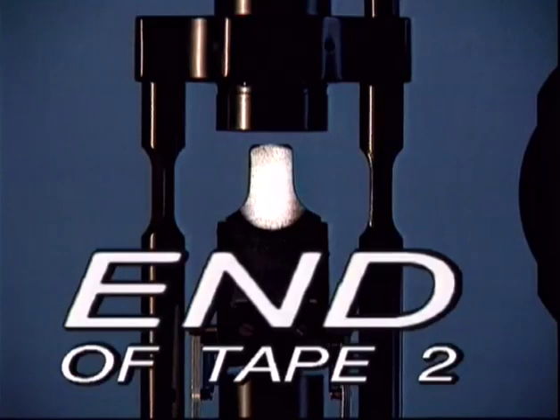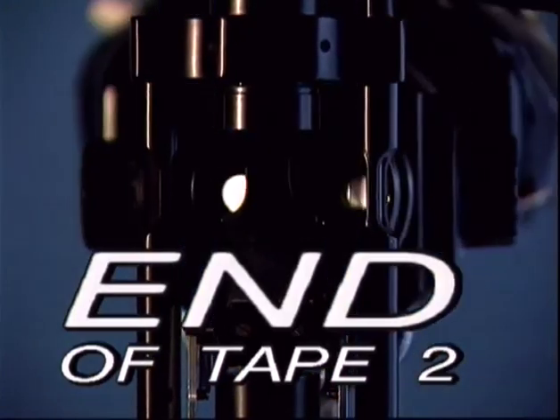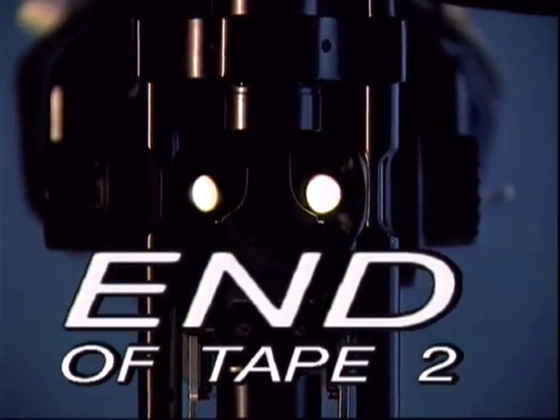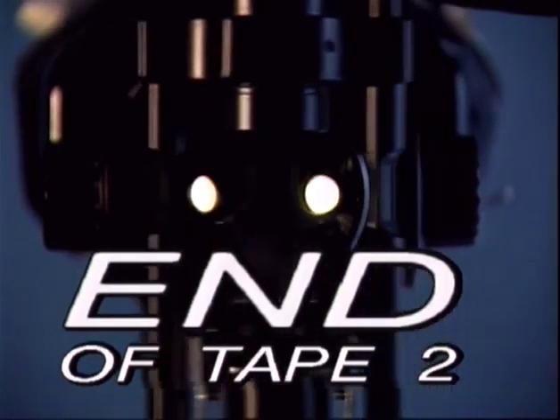This is the end of the second tape of Part 1, Basics of Biomicroscopy. The next tape, Part 2, Practice of Biomicroscopy, will show the handling of the slit lamp for attaining optimal results.